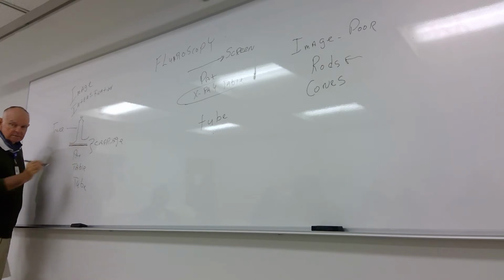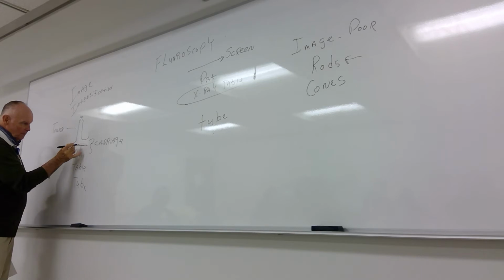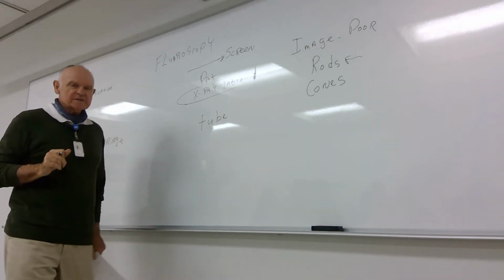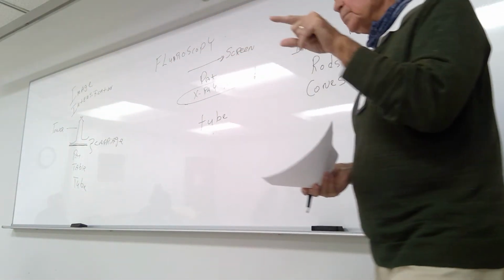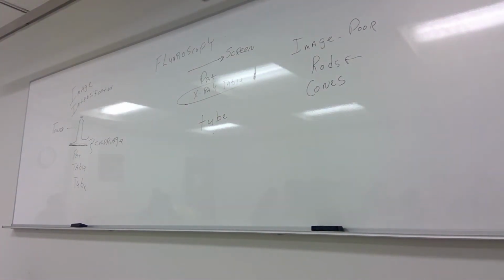This part here, the first layer right above the patient, has something called an input screen. It absorbs radiation and converts it to light.